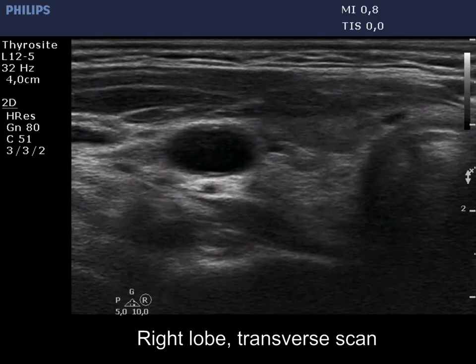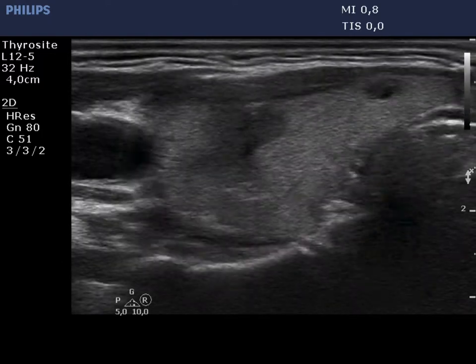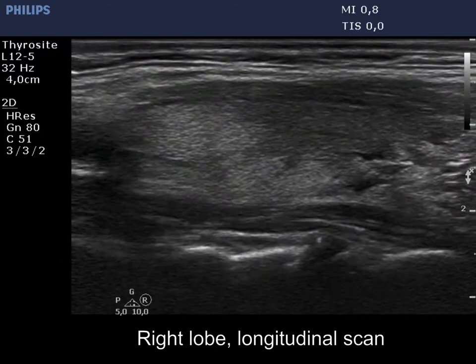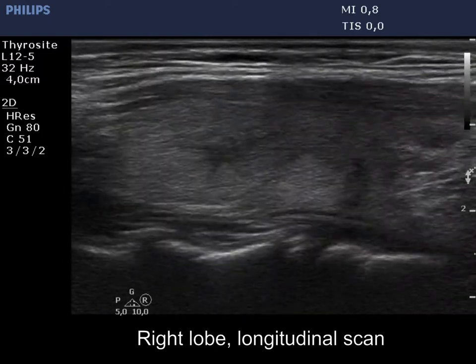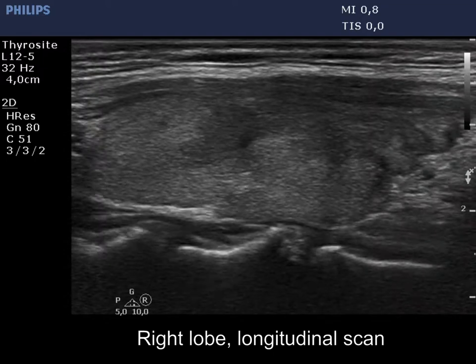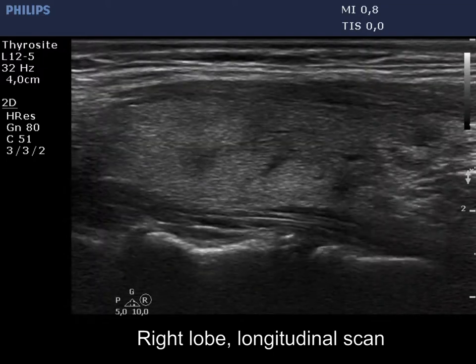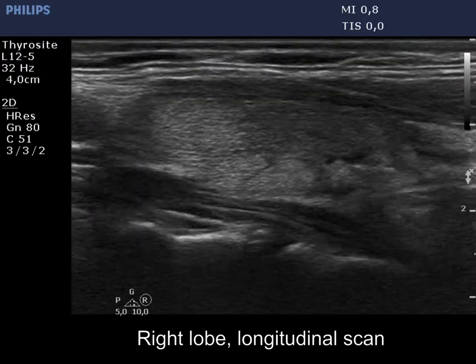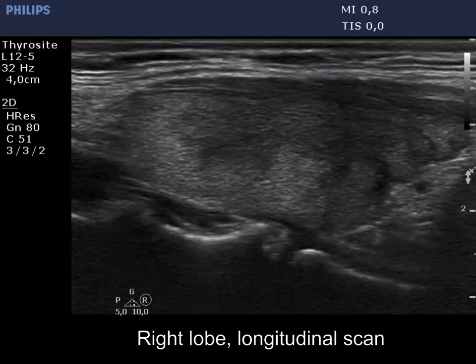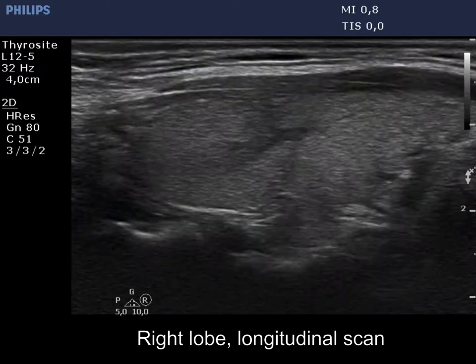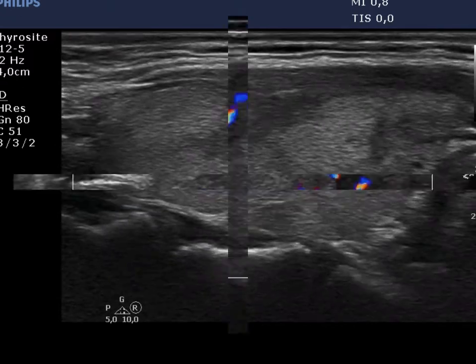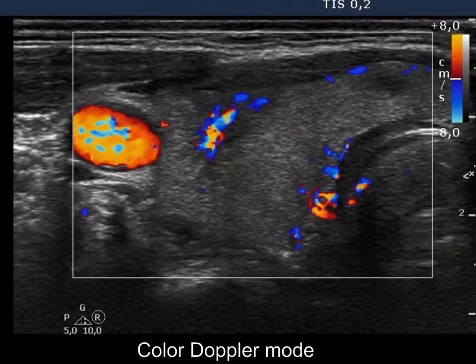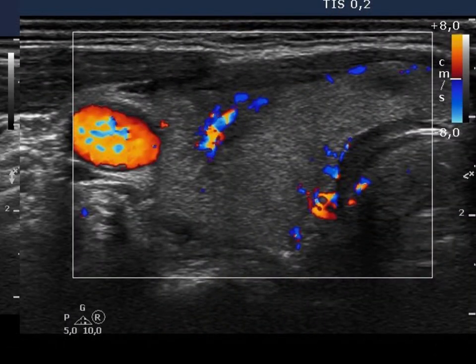Both the proportion of the hypoechoic areas and the degree of hypoechogenicity decreased further in the right thyroid. The vascularization became normal.